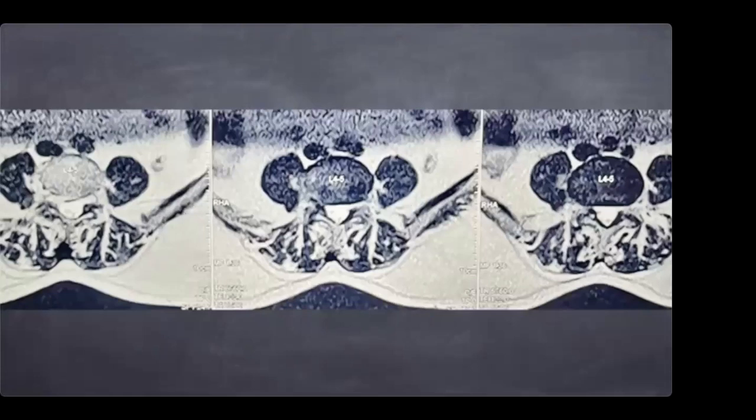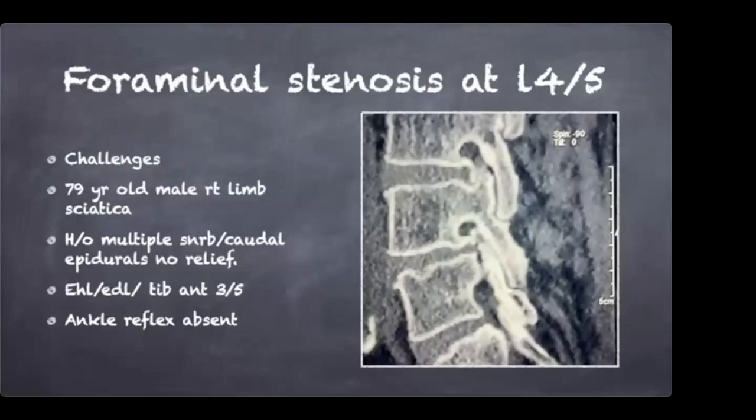And now, I decided to investigate him further. See what the CT scan shows. It shows something very shocking. At 4-5, we have severe foraminal stenosis. Severe. We have a posterior claw coming and a disc bulge. We have ossification in the flavum. We have a marginally upriding SAP.